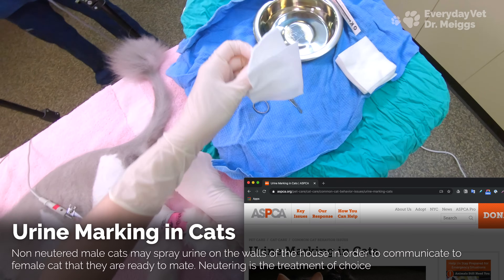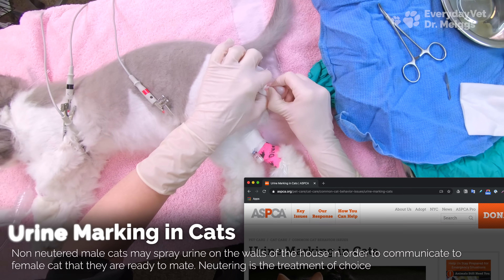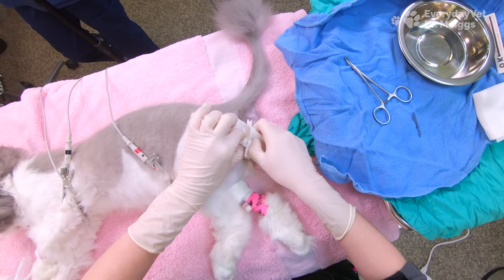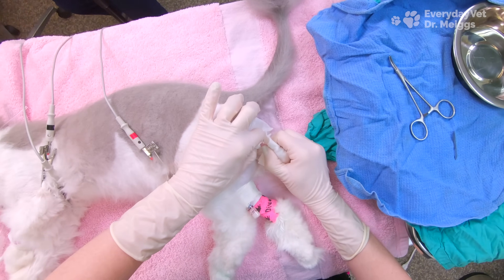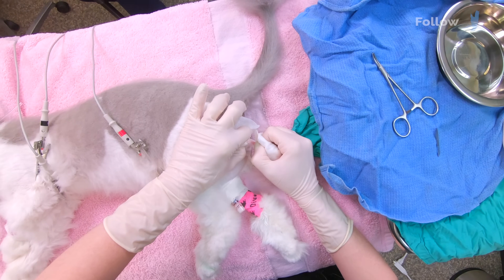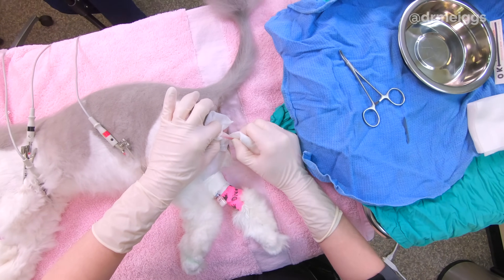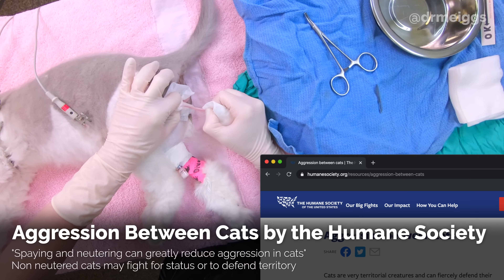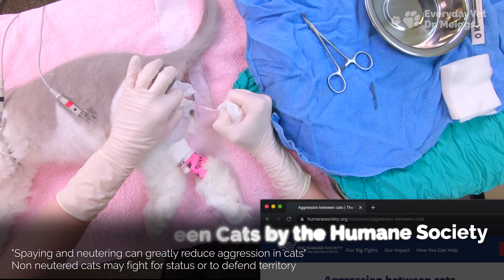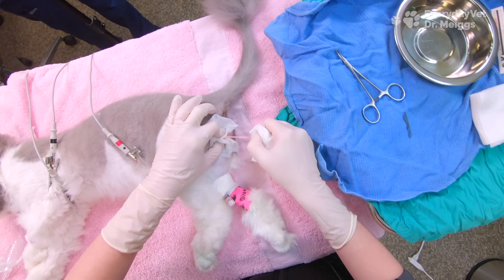Now that I've got the testicle exteriorized, I have to pull it further out of the body so I can get access to the blood vessels connecting to the testicle. When I'm pulling on this I'm expecting two distinct pops — once I've got those two pops I know I've pulled far enough. And that was the first pop. The second one's a little bit more gradual, as you'll see. And there's the second pop.